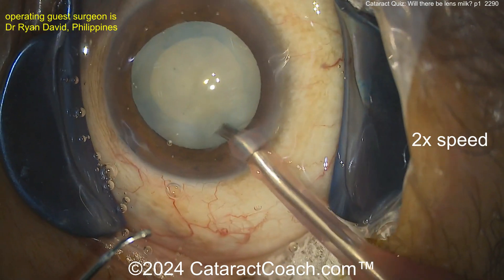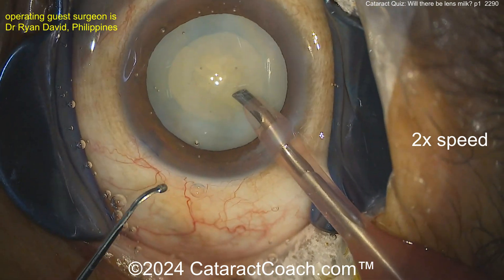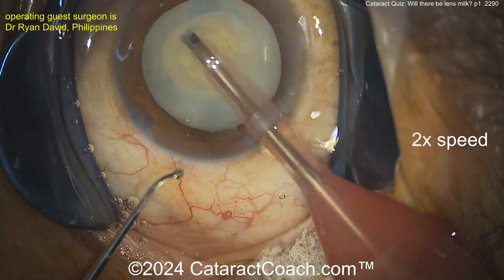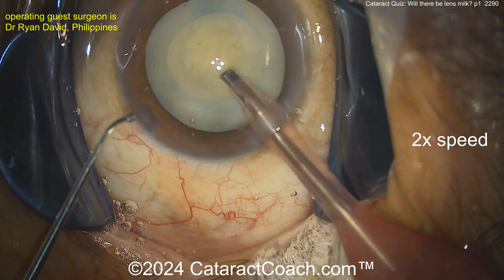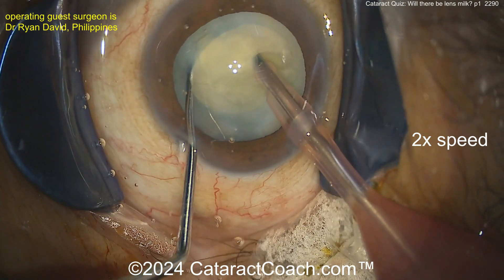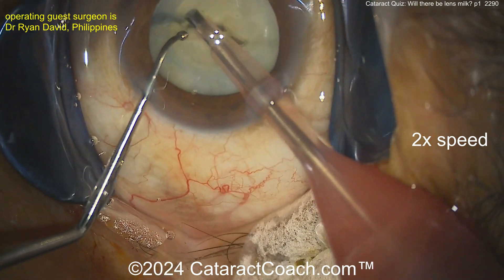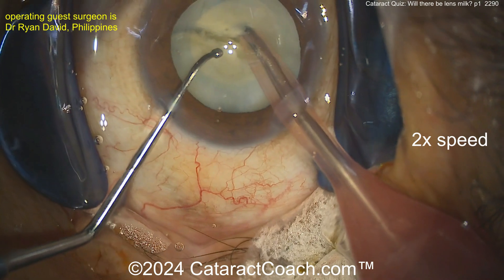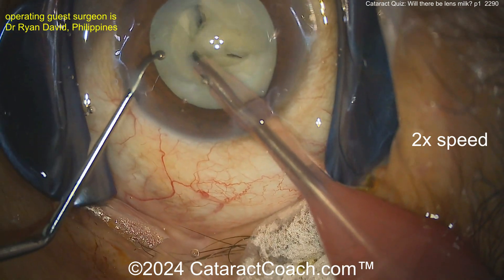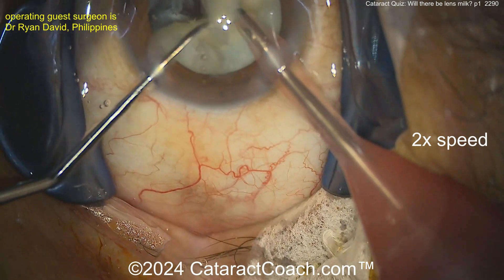Time to get the phaco probe going. The surgeon could probably do some chop - there's a chopper in the left hand, looks like a ball-tip chopper, phaco probe in the right hand. The rhexis looks pretty good. Cleaning up some of that anterior lens material. Going to do a horizontal chop with that chopper - you're not going to do a vertical chop with that instrument. Horizontal chop it is - look at that, boom! That chops beautifully, not too dense.